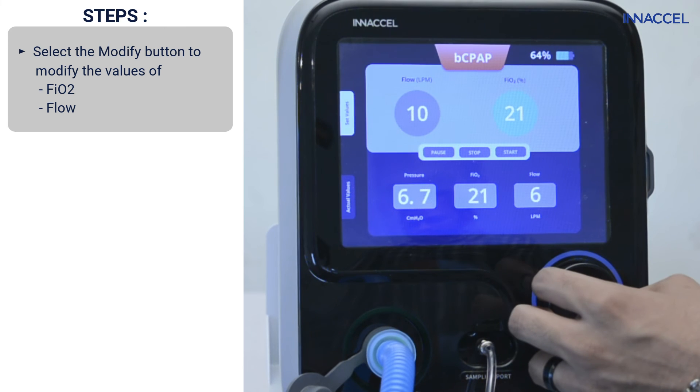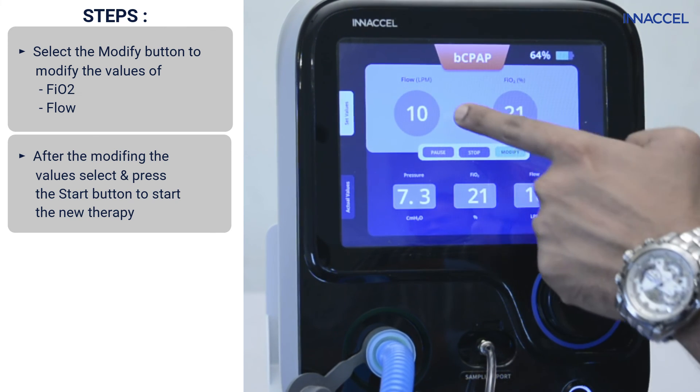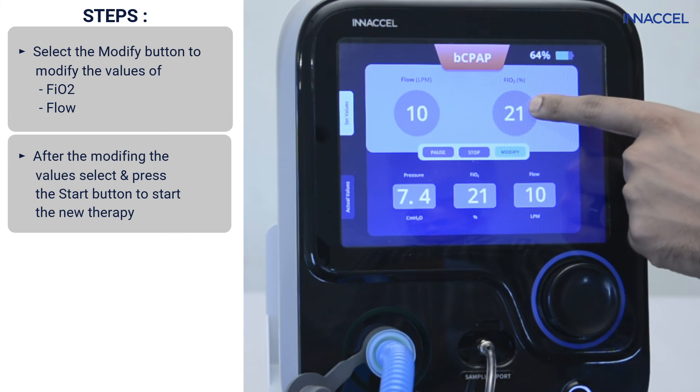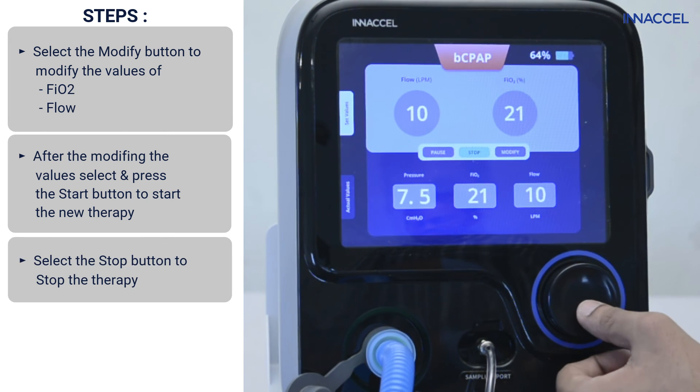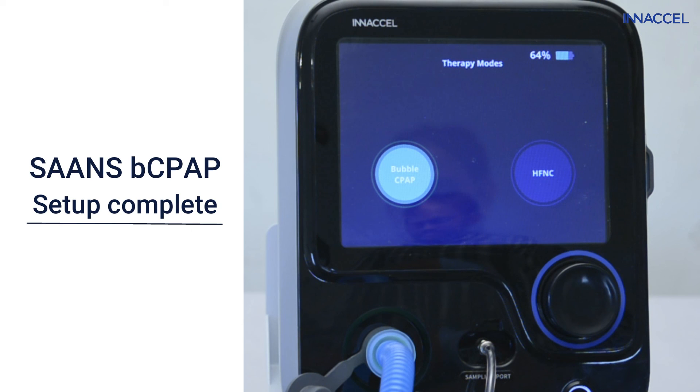To start a new therapy with new values, press start again. To stop the therapy, press the stop button. Your SAS device setup for bubble CPAP is now complete.